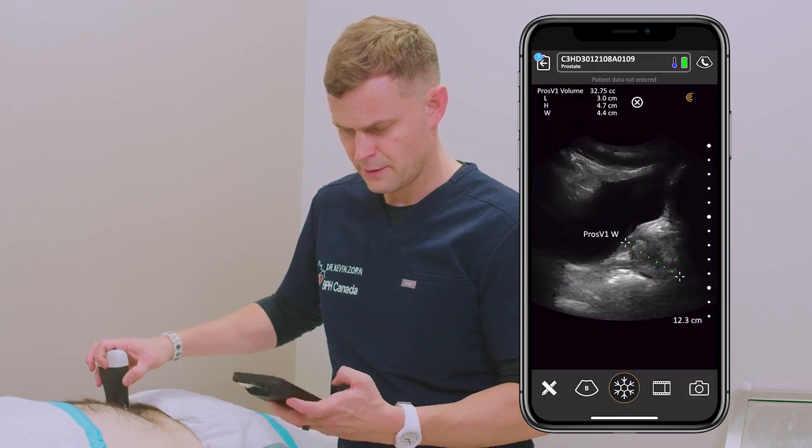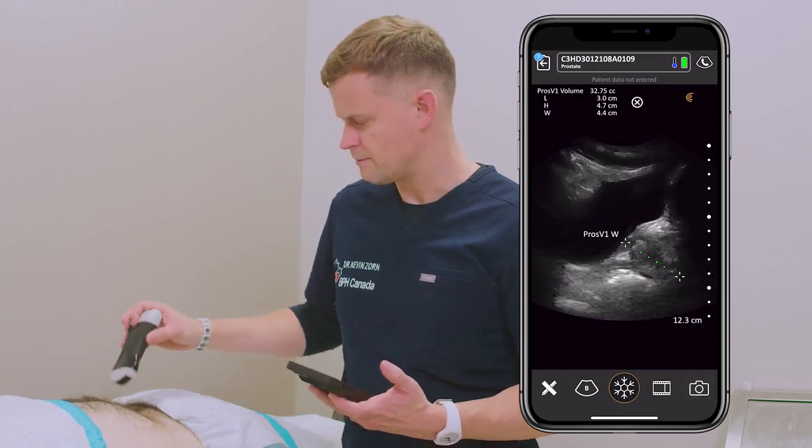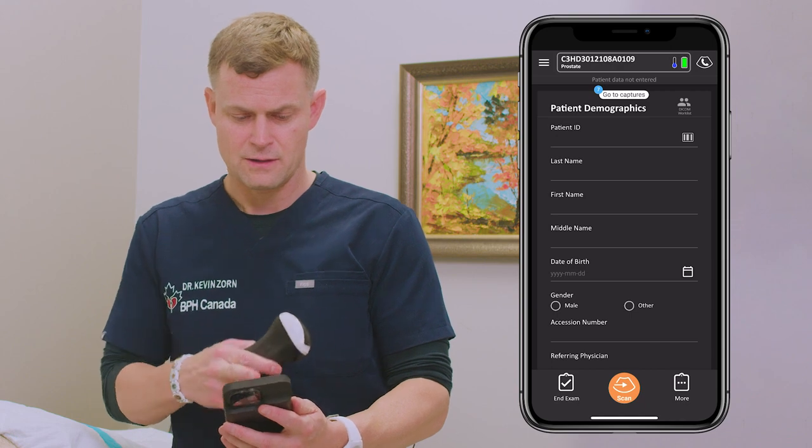All within a matter of a few minutes I've got the pertinent information for anyone with BPH or lower urinary tract symptoms. We will have their bladder status, the bladder wall thickness, making sure there's no secondary endpoints of chronic BPH such as diverticulum or stones, and finally the prostate anatomy — the length, height, and width — and the absence or presence of a median lobe. So this completes the ultrasound findings, and I'm going to move toward a final summary report.